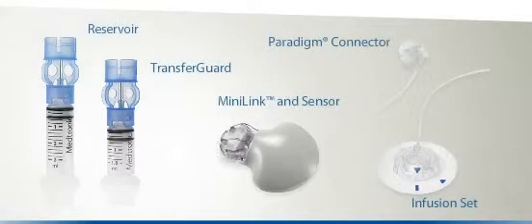Before we go on, here are some of the items you will need. A Paradigm reservoir, integrated with a transfer guard. A Paradigm infusion set, which connects the Paradigm VEO to your body. And finally, the mini-link and sensor, needed if you are using the Paradigm VEO's continuous glucose monitoring functionality.